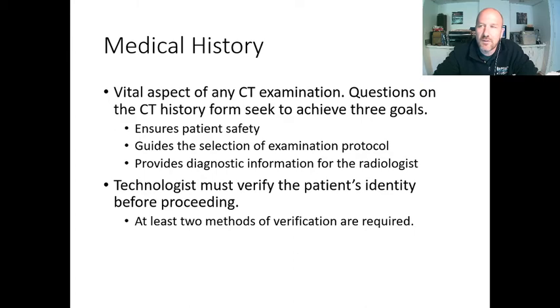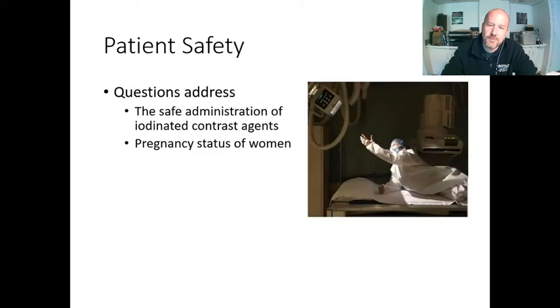And then finally, ultimately, to have that history to communicate to the interpreting physician so that they can understand why they're looking at the pictures that they're looking at, because we're going to give them a crap load of pictures. And if you're looking at like 1,000 pictures and you have no clue why you're looking at it, that could be pretty frustrating. And make sure you verify the patient's ID.